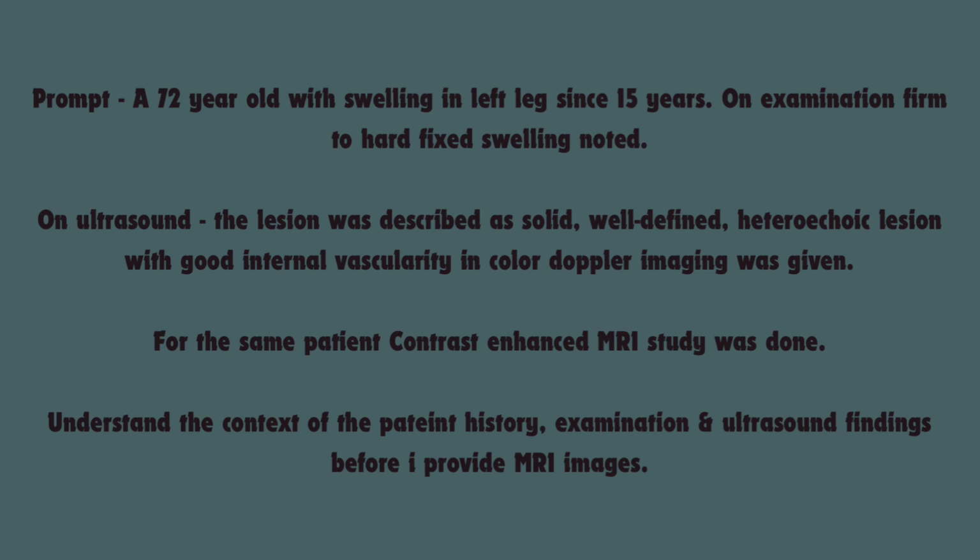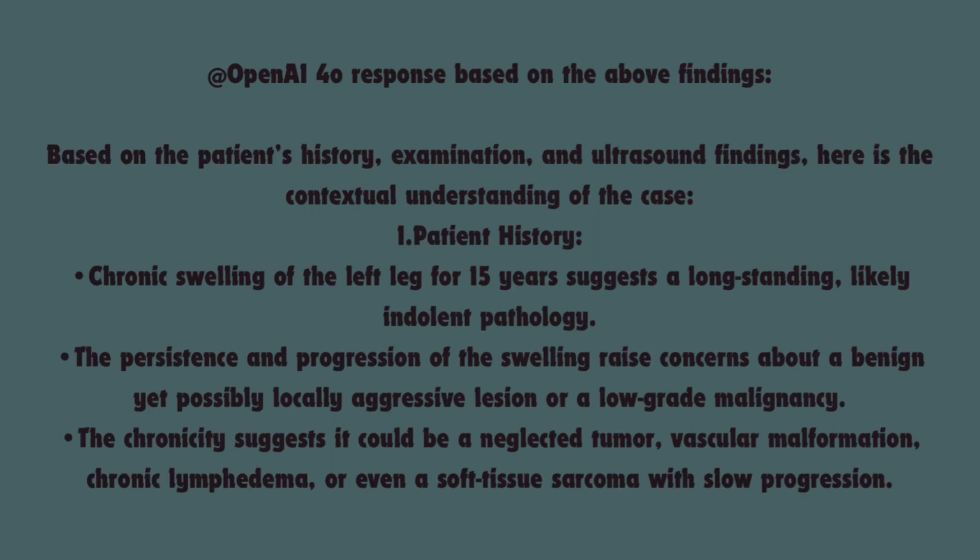So this case was about a 72-year-old patient, and they had swelling in their left leg. Okay. And they'd had this swelling for 15 years. Wow, that's a long time. I know, right? So what happened?